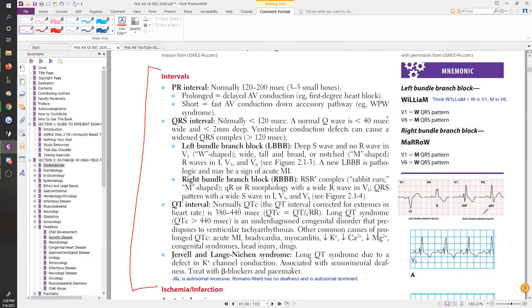Theoretically speaking, and you can see that right here, you should never really see an M on any QRS complex. And the W often tends to be the harder thing to see. In my opinion, I have more trouble actually grasping the W on a QRS complex, but finding the M on a QRS complex is actually much easier.